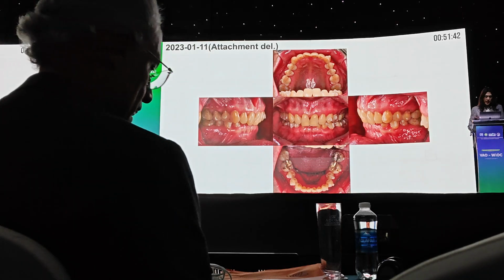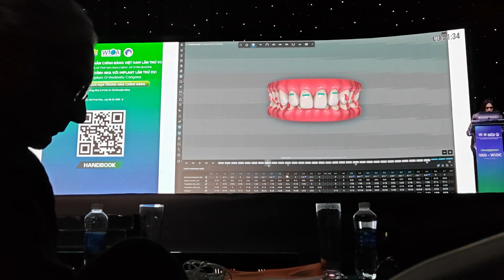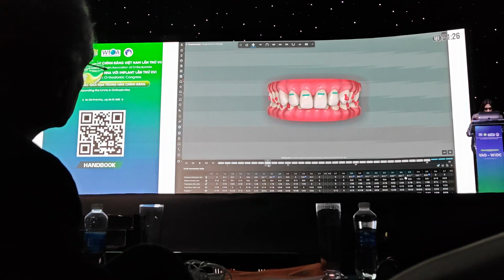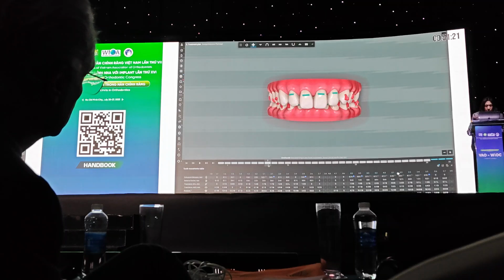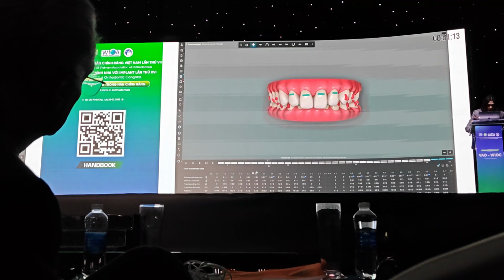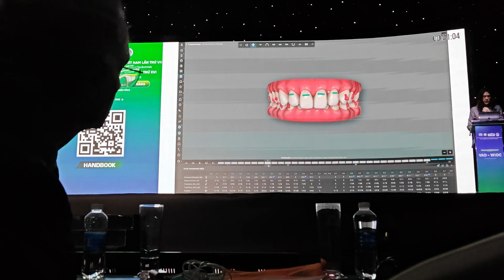And I delivered the attachments. And you can also see here on the tooth movement table, here the lower six anteriors, you see that the amount of intrusion is a lot here, right? 2 millimeters, 4 millimeters, 4 millimeters, 3 millimeters, and there are black dots here. And you see the blue shaded tooth numbers, which means that there has been aligner activation designed on these teeth. And also the upper incisors are blue shaded, which means that aligner activation is built in there. And also there are power ridges to correct the torque of the upper incisors.